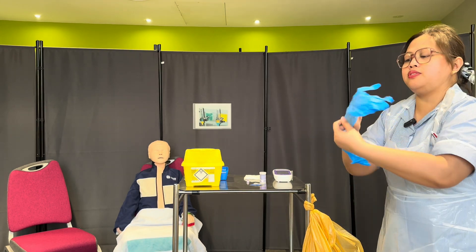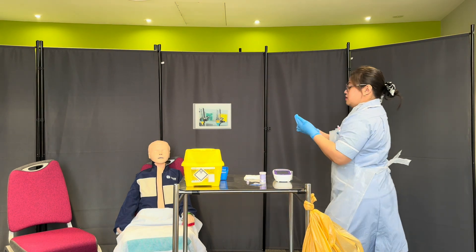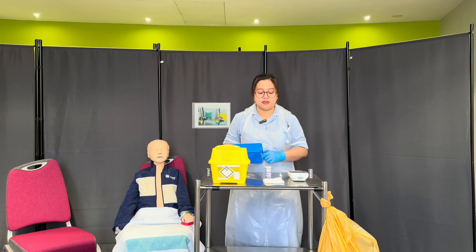Alexander, can you confirm if my tray is disposable or reusable? Disposable. Thank you. So I have here my disposable tray — it's clean and dry, so I'll be happy to use this.